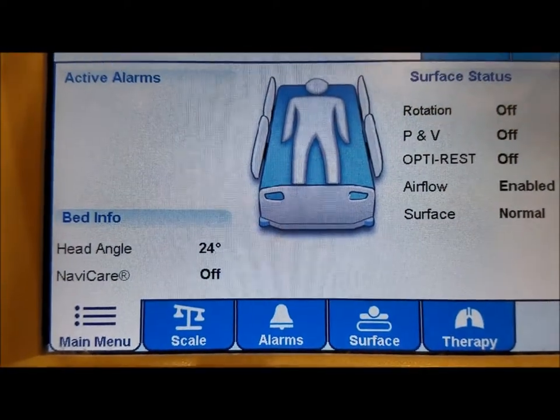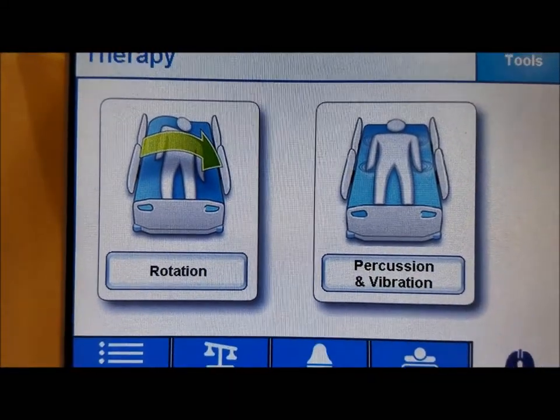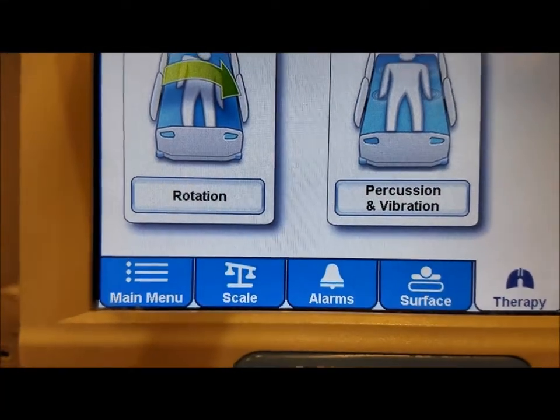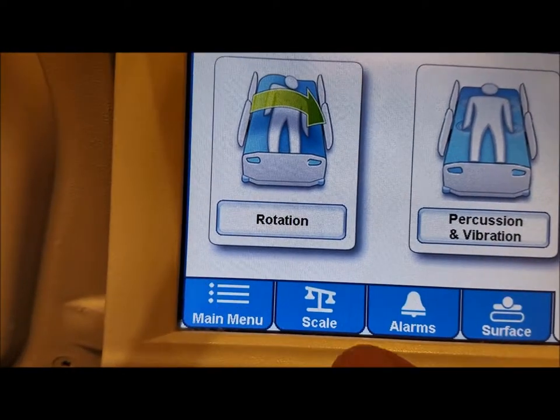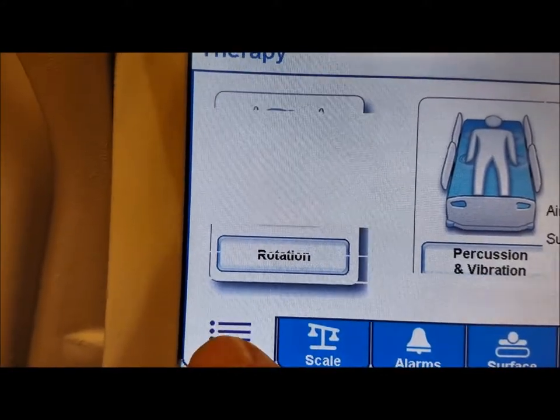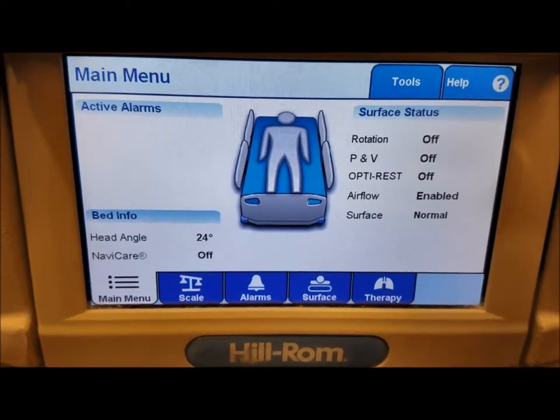But you've got the therapy setting right here, which is going to allow you to set up the percussion vibration or the rotation feature. The low air loss is going to run the air conditioned layer over the top of the mattress to keep the patient cool. You also have bed exit alarms. We've got the scale feature to weigh the patient, and then you've got the main menu. And as you can see, this is all being run off of a touchscreen surface.